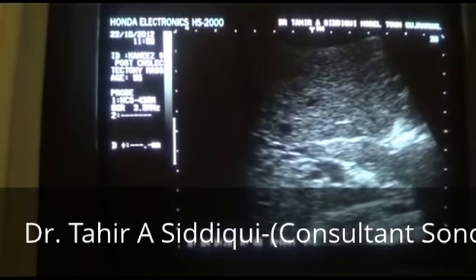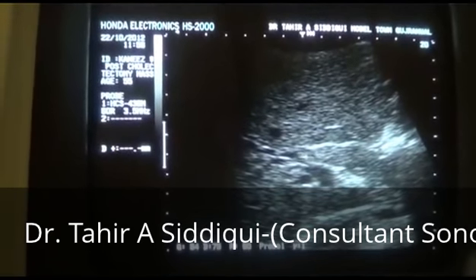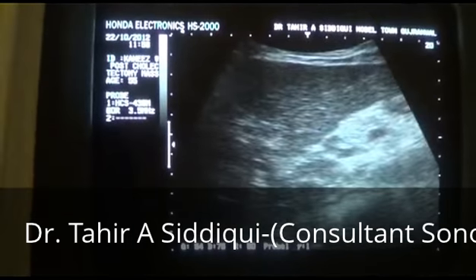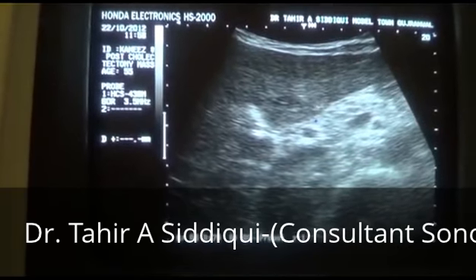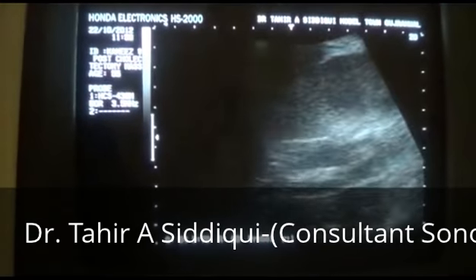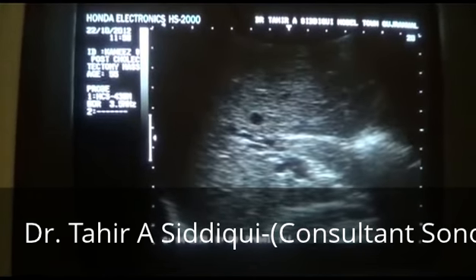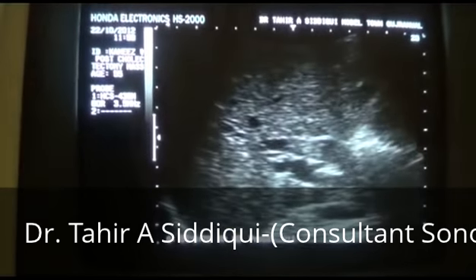This is the common bile duct, this area, and it is filled with echogenic material. The sludge, this is the portal vein. And here is the head of the pancreas. This is the head of the pancreas. It has no relation with the pancreas at all. Pancreas is absolutely normal. And this is the finding which indicates that this is sludge in the dilated common bile duct.